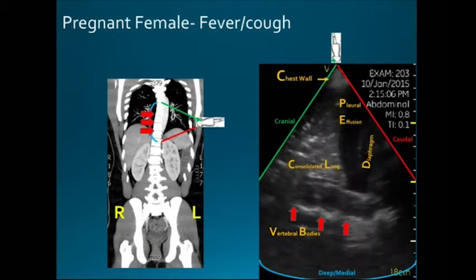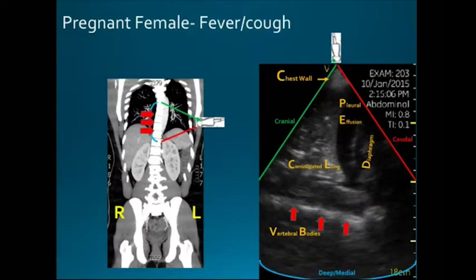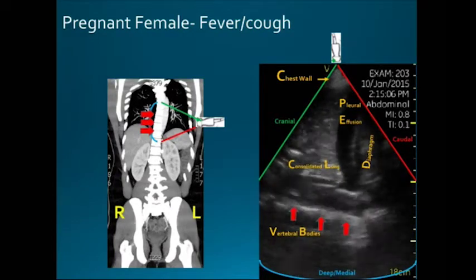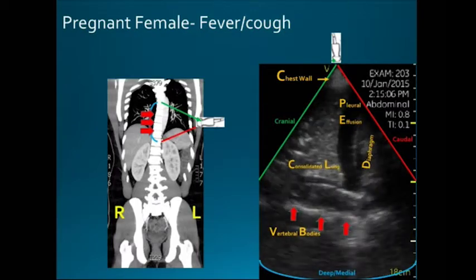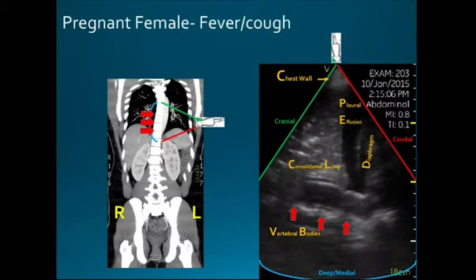to look for something that, when you looked with the ultrasound, this again is the diaphragm here. This is up in the chest. This is below the diaphragm here. This is the abdomen. So we're kind of coming across the body like this, or in this case, like this. And using the ultrasound beam to view into the chest, you can see she's got a little bit of black around her lung here. So she's got a small little pleural effusion, but she's got a very densely consolidated lung.